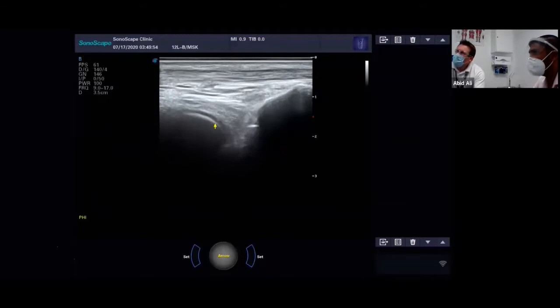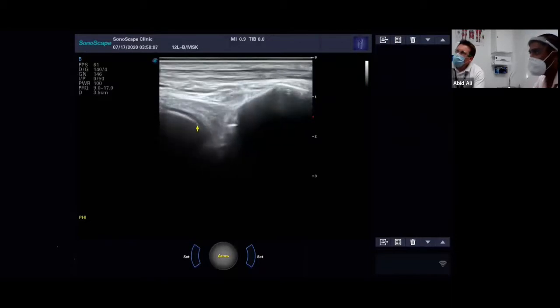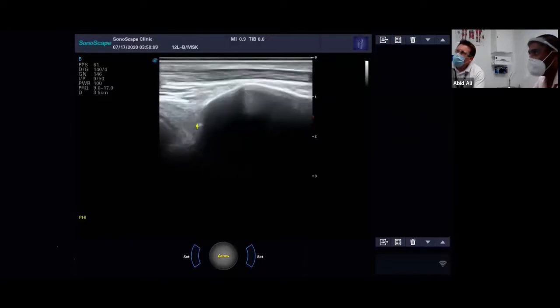I do aspirate quite a lot. You can get a big effusion, you can get a medium effusion or a small effusion. Yeah. Anything ranging from 1 mil up to several mils, I think. And of course, it's space-occupying fluid, so it gives quite a bit of pressure inside the joint and can be very uncomfortable. We always look out for erosions as well.